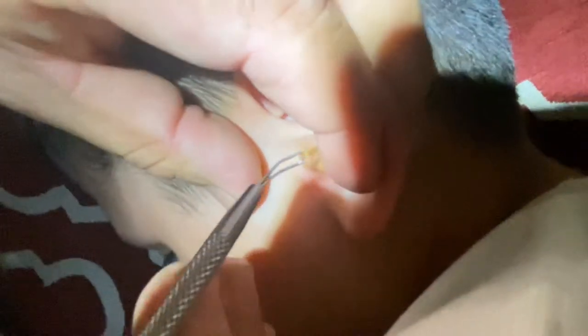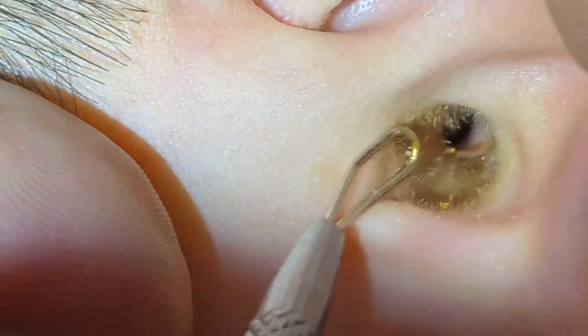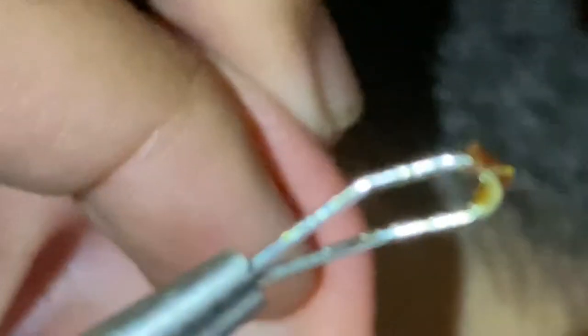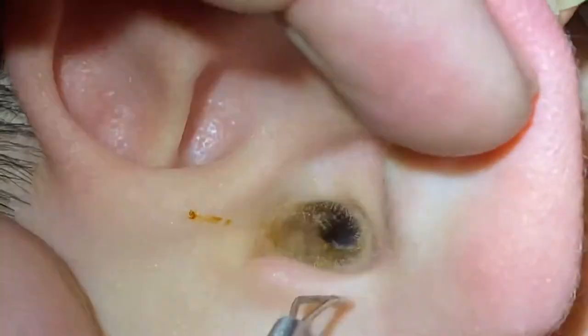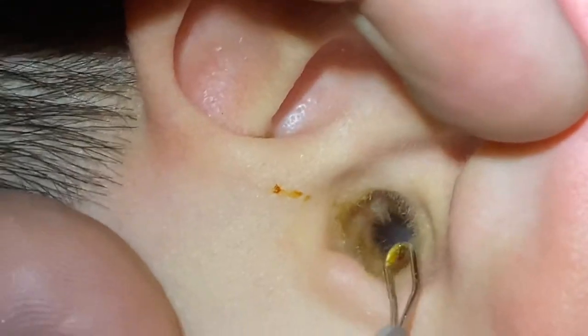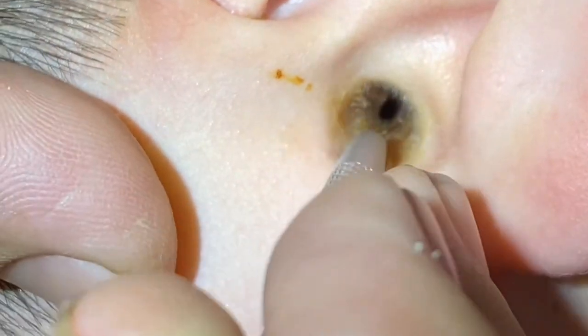Let me zoom in there — I think it's clean actually, almost. Wait, I see something back there, look at this. There's a little piece of ear wax on your ear, right here. Is it a big one? No, it's kind of like — yeah, that can be cleaned up later. Let's see what's in that ear. It's kind of gross but not too much actually — look right here, I'm zoomed in so people can see.